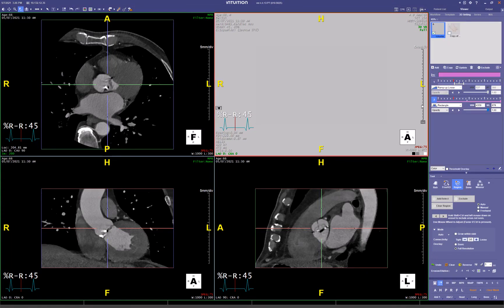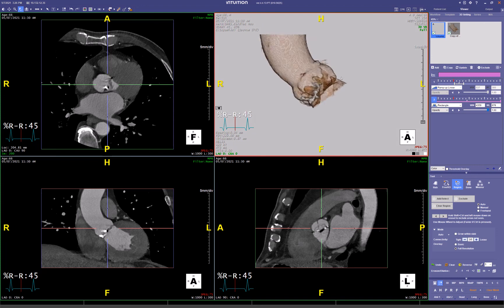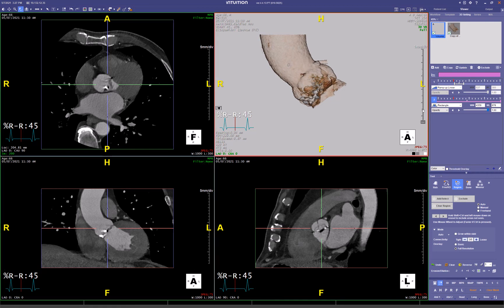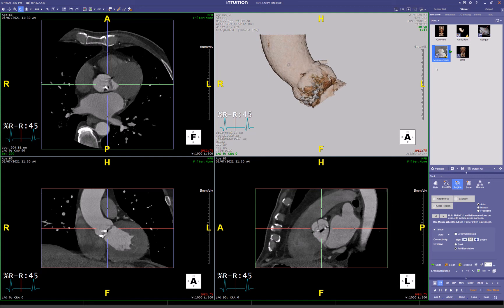Hi, it's Mike Winkler, doing post-processing again today with the Intuition client from Terra Recon. I'm processing a TAVR, and I've already more or less done a segmentation of the aortic root. We're now going to do our three cusp and cusp overlap views, so I'm going to switch workflows to the TAVR workflow.